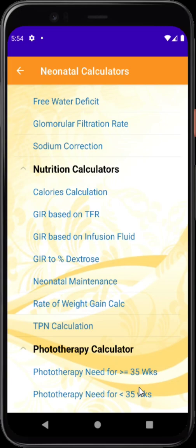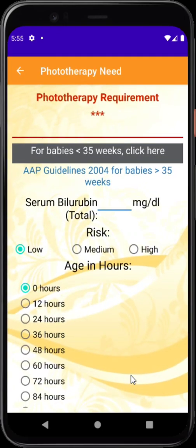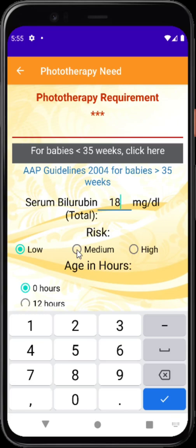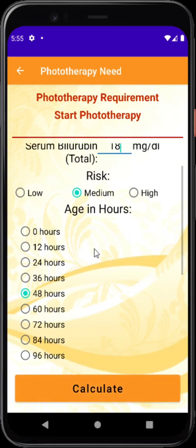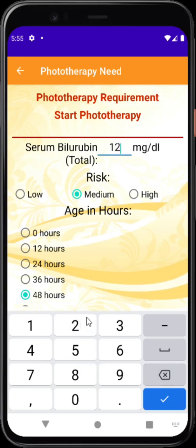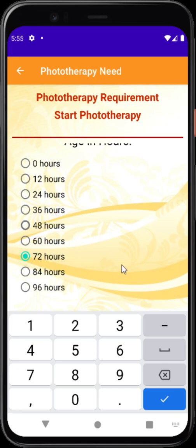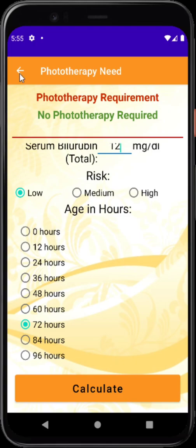The phototherapy calculator is very essential for day-to-day use. When a serum bilirubin value is given, instead of consulting charts, this app makes the decision easier. Based on AAP guidelines, it applies to babies more than 35 weeks. Type the bilirubin value — say 18 — select the risk level (low, medium, or high) and the baby's age in hours — say 48 hours — press calculate and it says 'start phototherapy.' If the value is 12, risk is low, and the baby is 72 hours old, it says no phototherapy is needed.